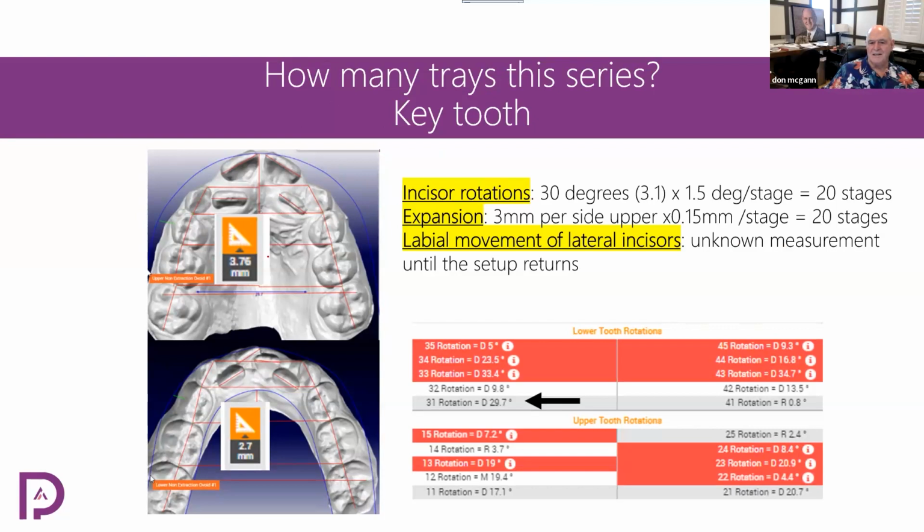Okay, so this one, let's just look at this. We have expansion. 3mm, 2mm. Can I do this in the mixed dentition? Yes, I can. I can push out not only permanent molars, but primary molars. Okay, I can expand. Can I close this space? Yes, I can, making more space for these lateral incisors. Can I push the lateral incisors out? Yes, I can. Maybe I want to take out the upper C's. Maybe I don't. Give me a 7mm bubble right here, or make it like 7mm so this can push into there. Go ahead. Let's start right now. Fix the anterior crossbite. Okay.